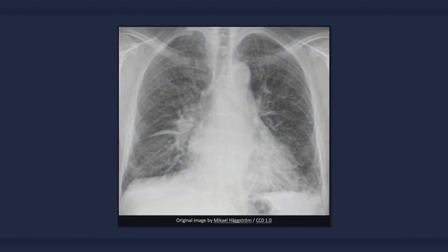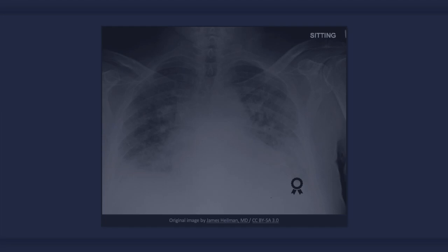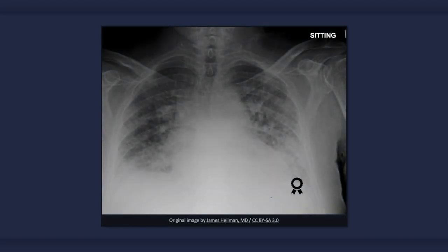Alveolar edema is a more severe sign of congestive heart failure and is not clearly evident in the radiograph we have thus far been examining. In this image, many of the aforementioned findings are present, plus alveolar edema, which classically results in central and symmetrical airspace disease. The outer third of the lung is frequently spared, resulting in a characteristic batwing configuration. However, the patterns of pulmonary opacification are variable and can be more or less diffuse, asymmetric, or patchy.